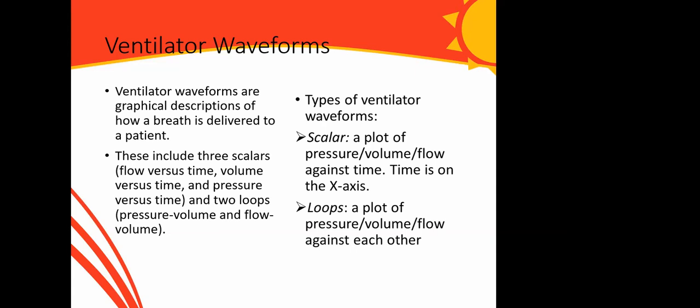So in order to increase the respiratory output, you give them more time at expiration, not necessarily by increasing pressure during expiration. Giving pressure during expiration is basically to improve oxygenation and not to increase respiratory effort.